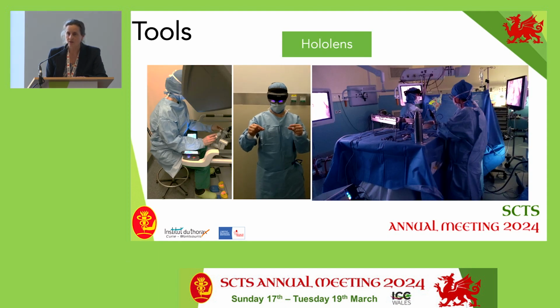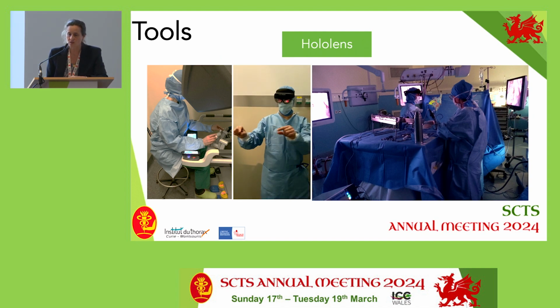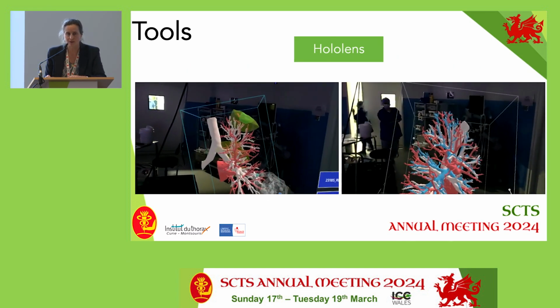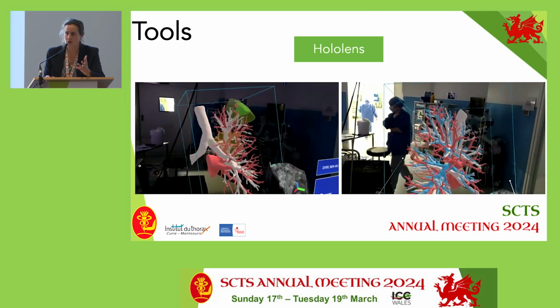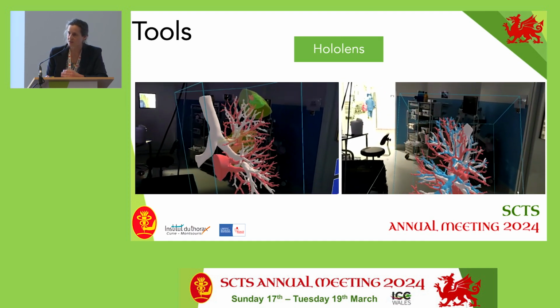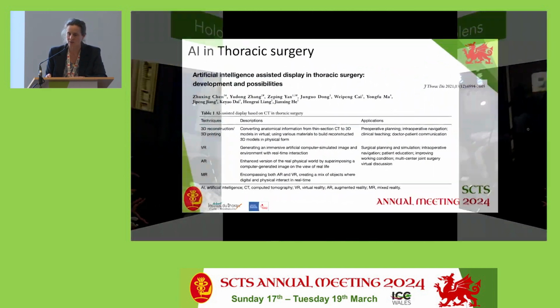And for example, in the robots, where you do not have the 3D reconstruction plugged in, you can have also the mask and try to see what happens on the model. So it's just like I'm a clown, but in fact, I'm trying to get the models, turn around the models, add the vessels, and confirm the anatomy that sometimes I'm doing during the dissection.